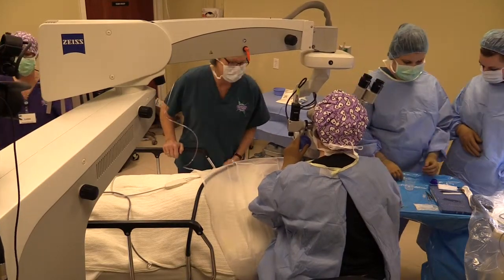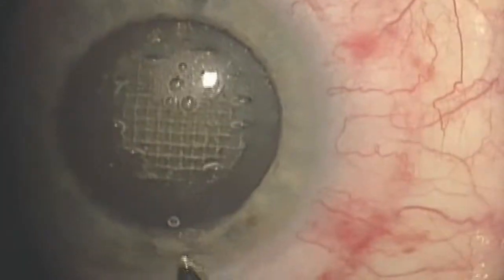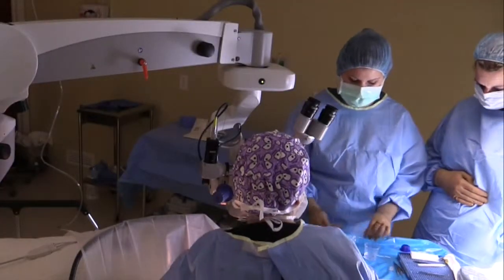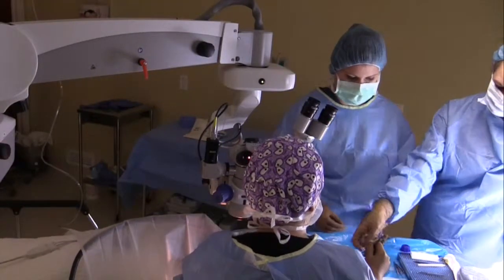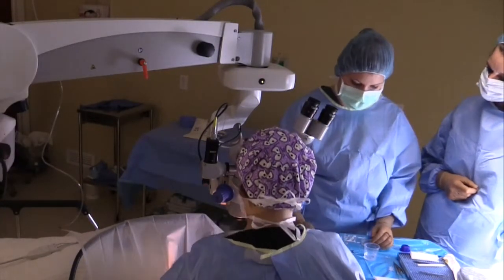Thank you. Now, again, if you'll look into the screen, you can really see that grid pattern. That grid pattern is pretty impressive. And see how absolutely perfectly it's outlined there. So the first thing we do is open the incisions that the laser created for us. We have a little blunt instrument here. And the first thing I'm going to open, if you look at the light for me, Ms. Brown, is my little side port.